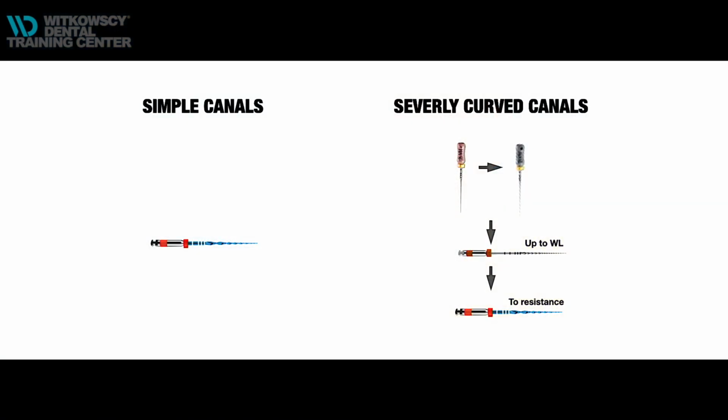Most of the times you will reach the apical zone, but sometimes you will not be able to reach the apical zone. So remember, try not to push this file too much. Of course, if you are dealing with severe curvatures, you can use the files with taper 04 size 25 and you'll be more than fine. Most of the cases with abrupt curvatures you can do with 25.04 or even 35.04. You can finish up to the apical zone with proper shaping protocol.